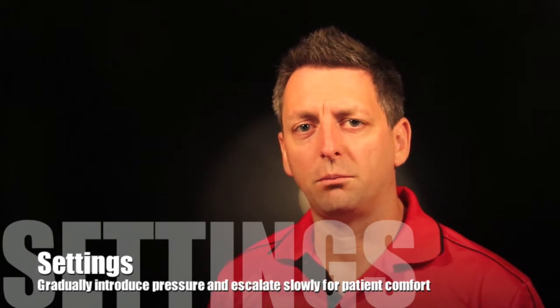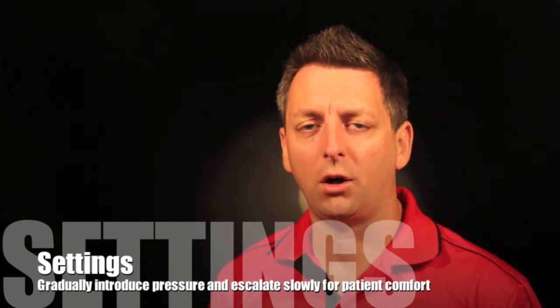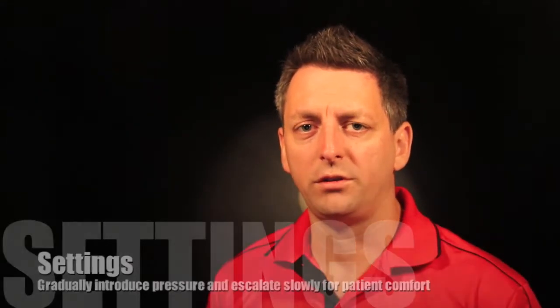I like to set my pressures very low just to get the person used to a mask. They're breathing very hard to start with. They're not cooperating too well with you. You're putting a mask on their face. If you start shoving hardcore air into their face, they're going to chuck it off. They're going to hate it and pull it away and become more agitated, more short of breath, and the whole cycle cascades. So explain to the patient, we're going to start it off slowly, just low, gentle oxygen.